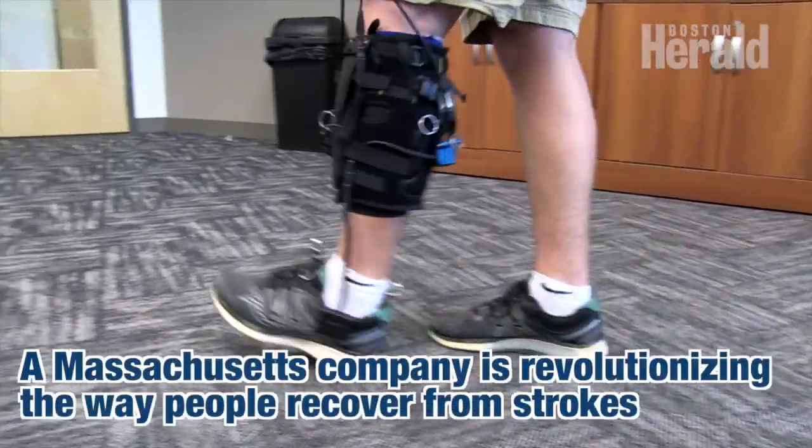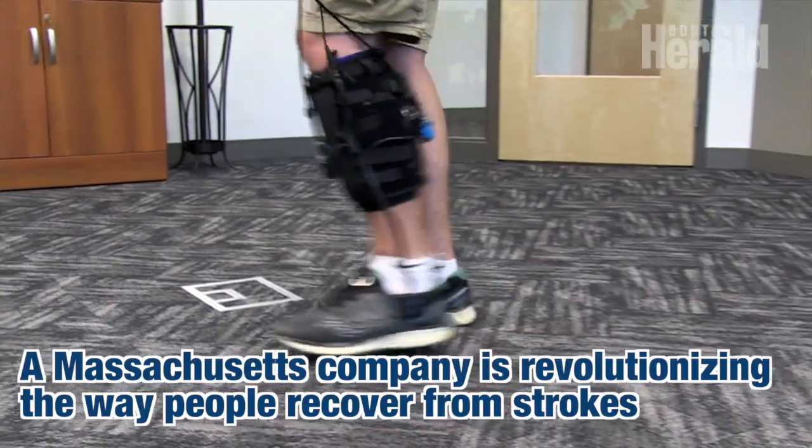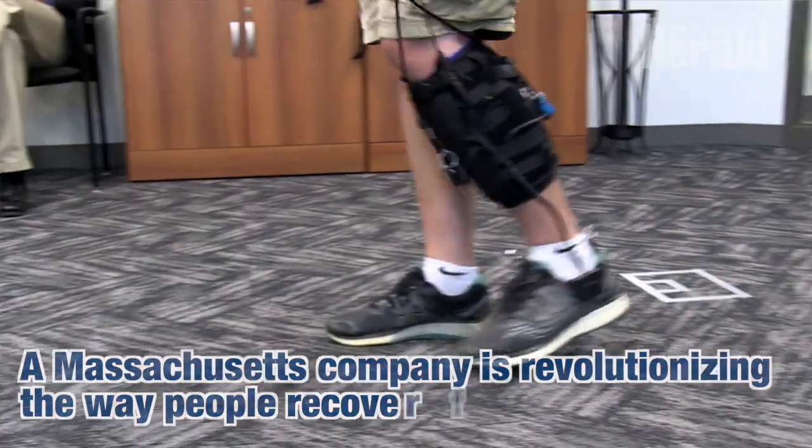It's called the Restore by Rewalk and it's intended for patients after they've had a stroke, so with lower limb disability on one side. We think that there's a broad application both for people who have recently had their stroke and also for those who are further down the line and maybe had their stroke several years ago but are still not happy with their walking quality.